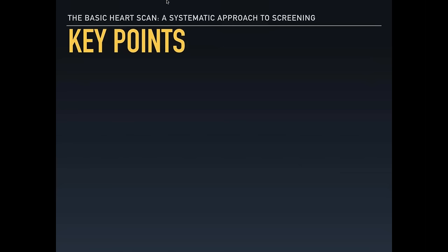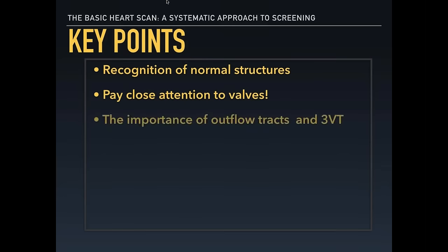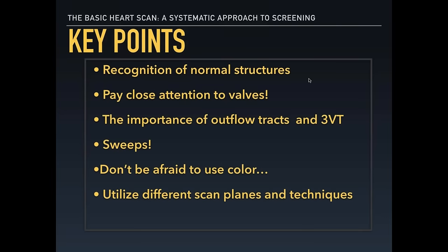So just a few key points to keep in mind when screening the heart. You want to recognize normal structures in order to recognize the abnormals. You also want to pay close attention to the valves. Remember, valves come and go. Also, note the importance of including outflow tracts and the three vessel view and three vessel trachea view in your studies. Also, sweeps are very, very helpful as we're able to evaluate the cardiac structures in real time.